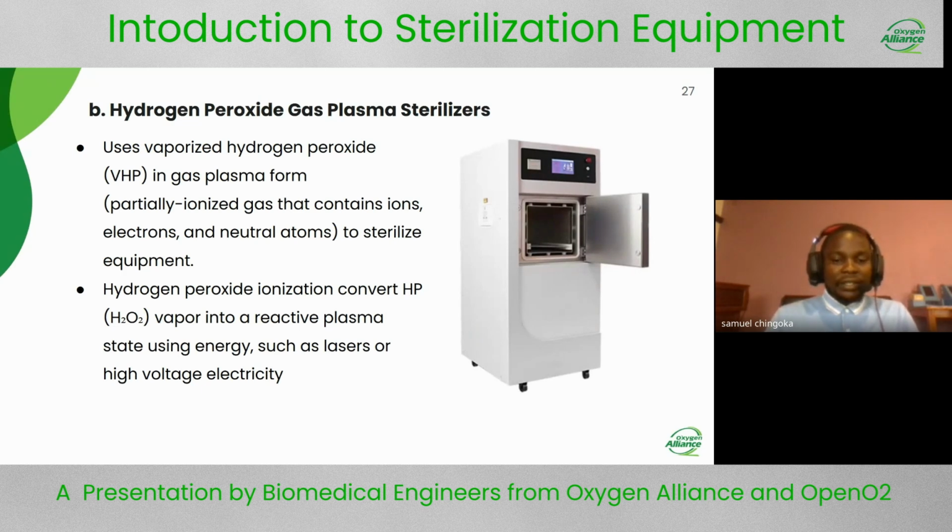What this slide says is that under normal temperatures, hydrogen peroxide is in a liquid state.